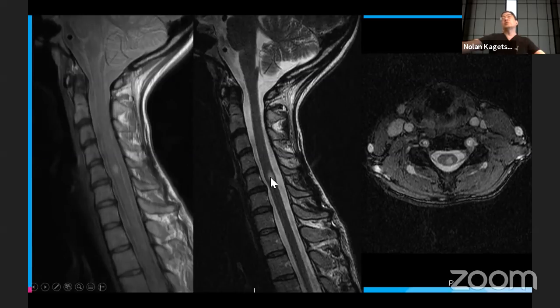There have been cases where this has been called a tumor, and the patient went to surgery and had a biopsy, but in fact, it turned out to be multiple sclerosis. And if this is multiple sclerosis, you shouldn't really be biopsying it. You should say, this could be multiple sclerosis. I guess it could be a tumor, but probably should sit tight and see if it evolves as multiple sclerosis. And you could also do imaging of the brain to see if there are lesions in the brain that would support the diagnosis of multiple sclerosis. So the neuroradiologist has an important role to give advice to the clinicians to make sure that the patients don't get unnecessary biopsies.